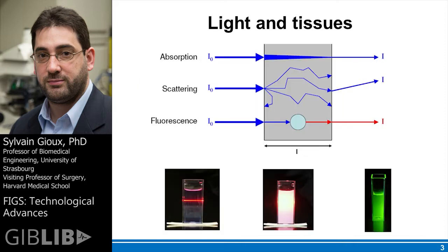So what's happening? A few things. First of all, tissue absorbs light, which can be depicted by this little cuvette measurement here. So light intensity diminishes as it travels through the tissue. The second effect is scattering. Scattering is formally the diffusion of these photons within the tissue. So tissue is not a very transparent medium. It scatters a lot of light, and primarily it's more scattering than absorption, actually.